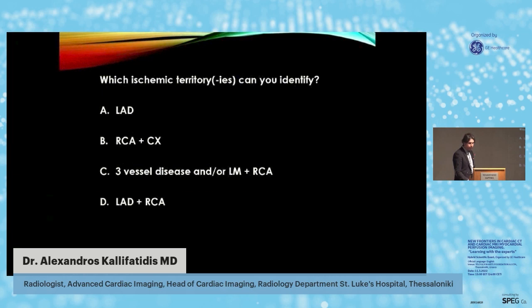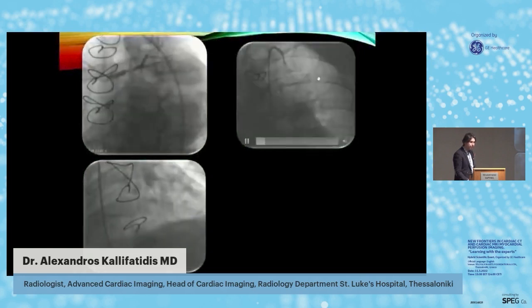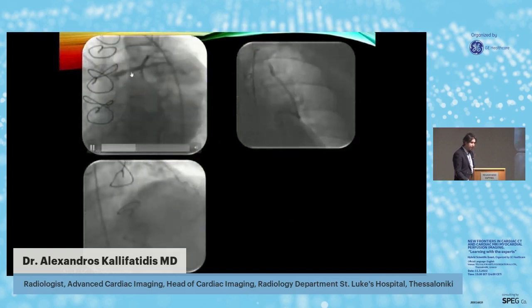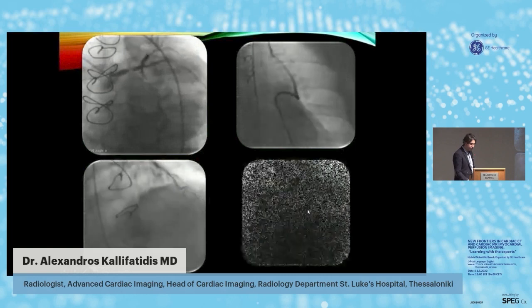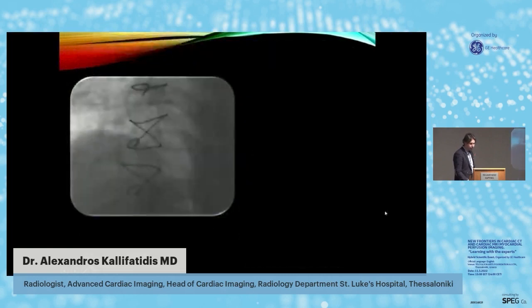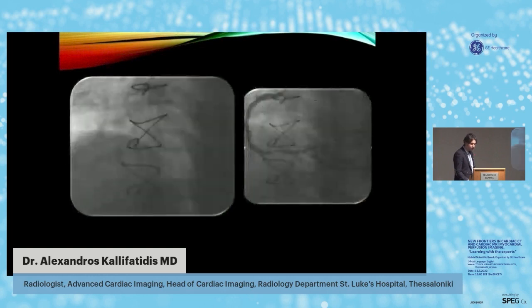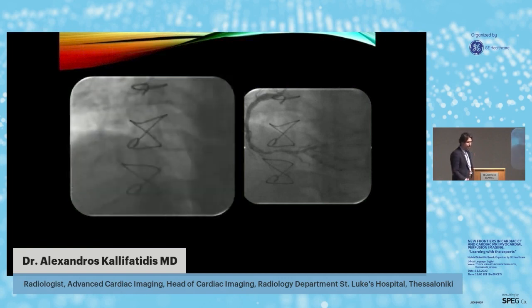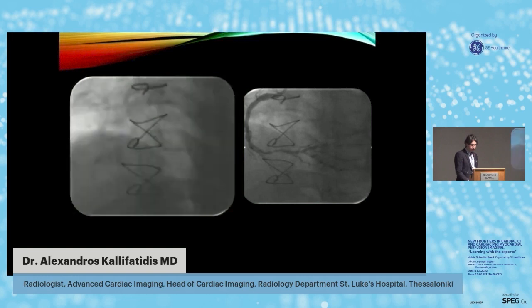Of course, this patient was referred for further exploration with catheterization, and as you can see from these nice projections, the bypass graft was patent, but we see this severe left main disease, also in the LAD and circumflex artery. In addition, we can see the right coronary artery also with severe stenotic lesions, and so this patient further had angioplasty for these severe lesions.